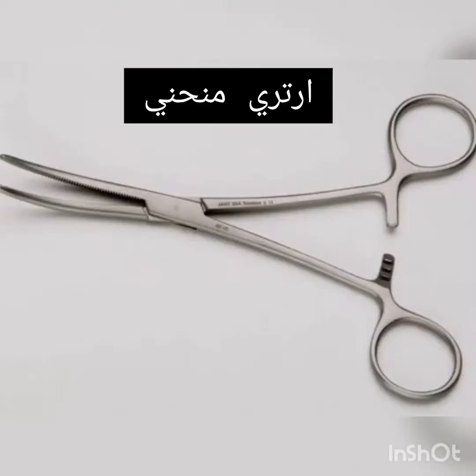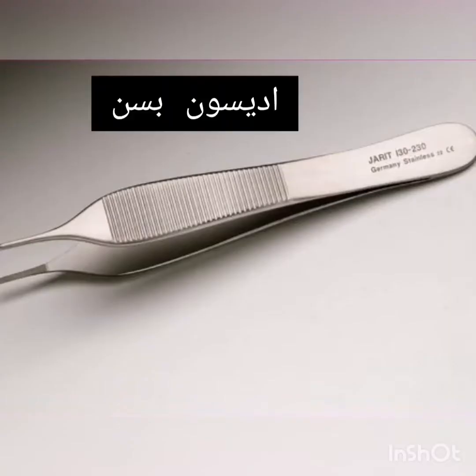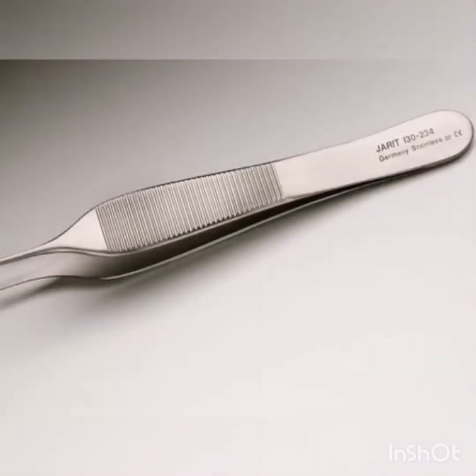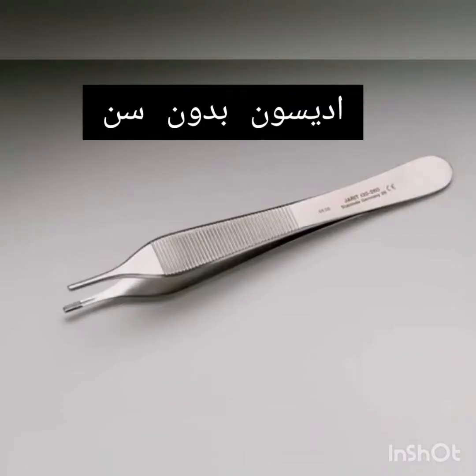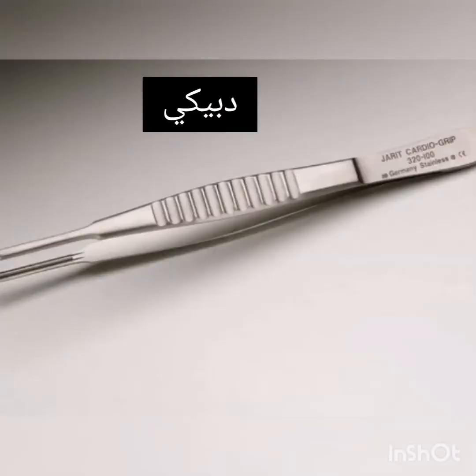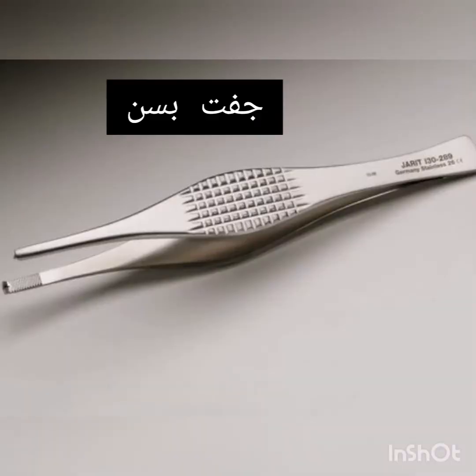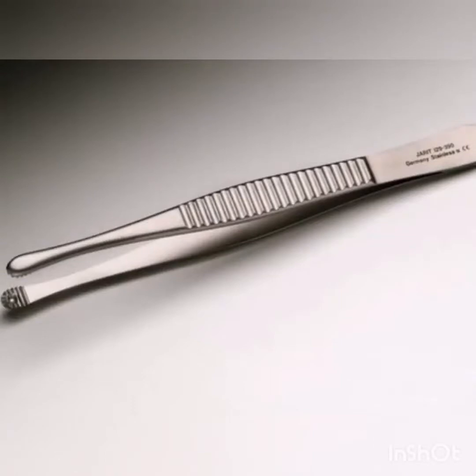Rochester Pean Hemostatic Forceps. Plain Adson Tissue Forceps. Toothed Adson Tissue Forceps. Brown Adson Tissue Forceps. DeBakey Tissue Forceps. Ferris Smith Tissue Forceps. Russian Tissue Forceps.